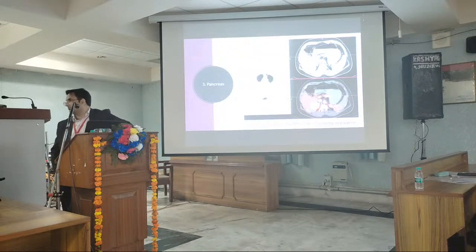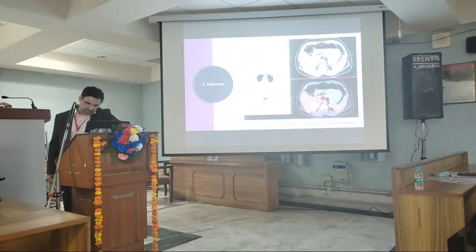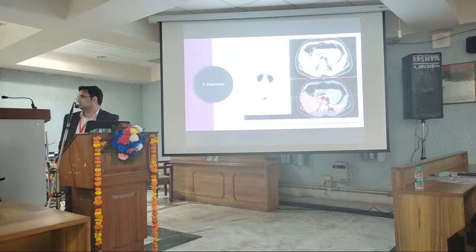Won't they pick up? There won't be a false positive? No, they don't pick up. So here we have to understand that these lesions could be true positives on a Dotanoc scan or an F-DOPA PET. So F-DOPA PET and Dotanoc PET are going to show uptake in all 4 lesions. But exendin will show uptake only in the culprit lesion which is producing the insulin, so that's why it's specific for the GLP receptor, which has specifically high expression.